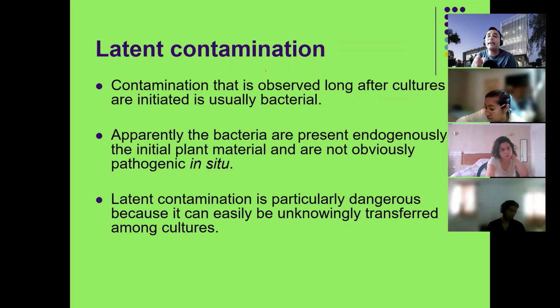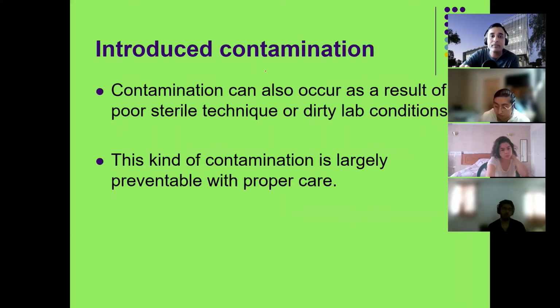That is why in most labs it is recommended that you test your media in an incubation chamber for at least 1 week, to avoid any uncertainty about latent contamination.